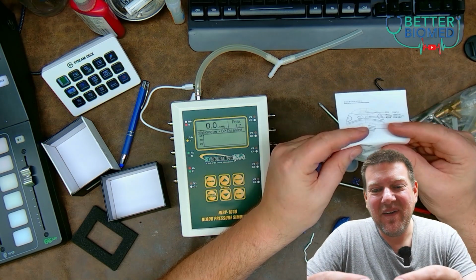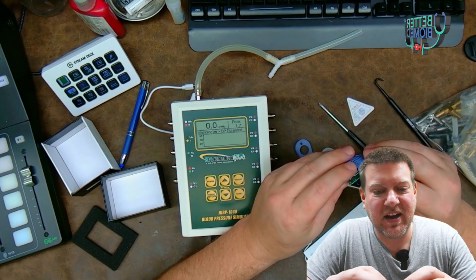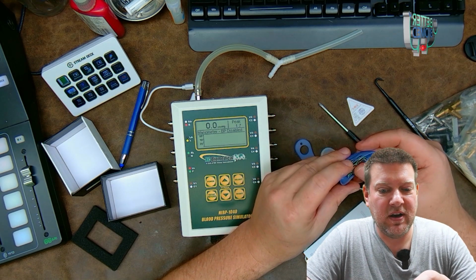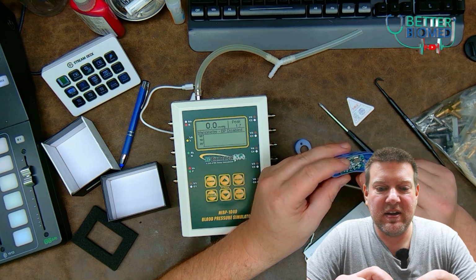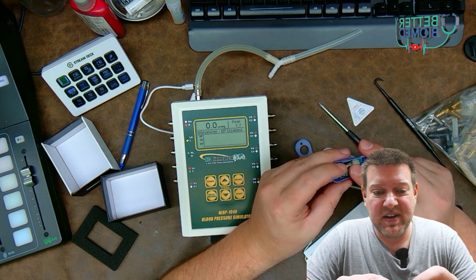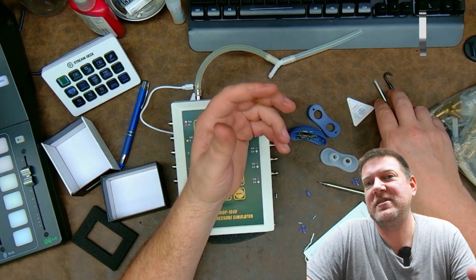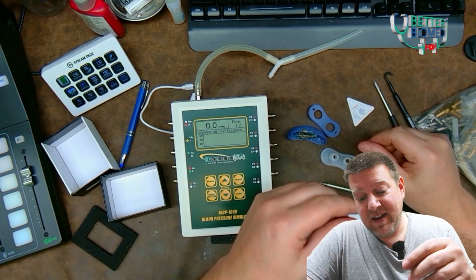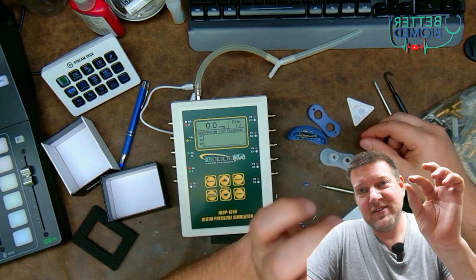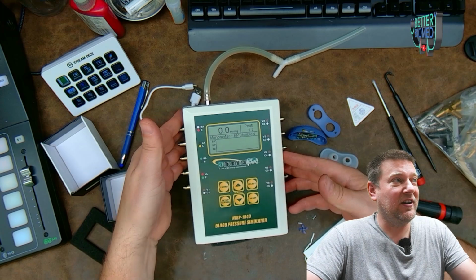What the heck? So as I said earlier, there is no oxygen concentration here. It is just a motor driver, and it's a two-channel motor driver. That's all it's doing, is spinning both those motors, and it's acting like a charge controller for the lithium ion cell as well. That's all it does. In order for it to be an oxygen concentrator, it has to provide you with higher than 21% oxygen, which is nominal atmosphere. This guy is a glorified fan, and it doesn't even do that well, okay? So it's not concentrating anything. It's not even concentrating air, because in other words, we would detect pressure on this guy here.